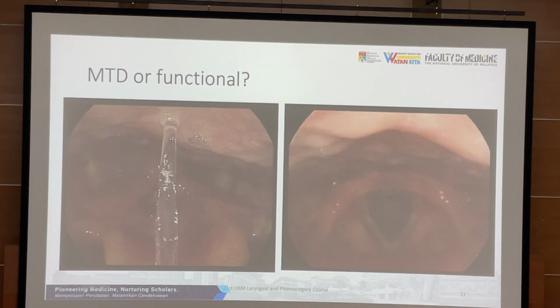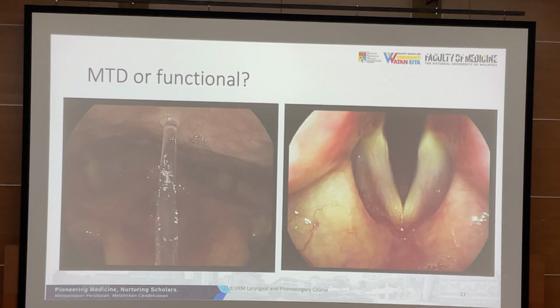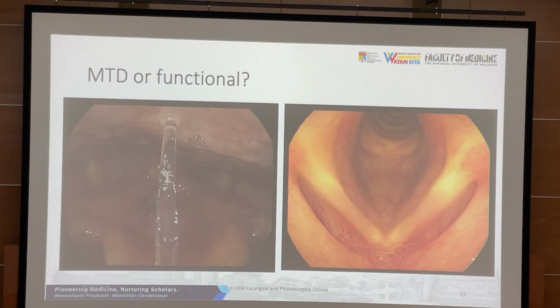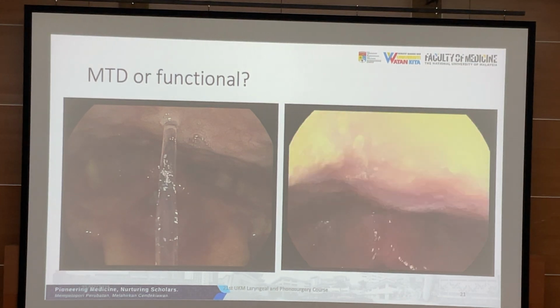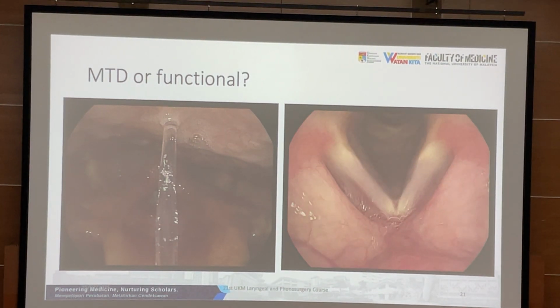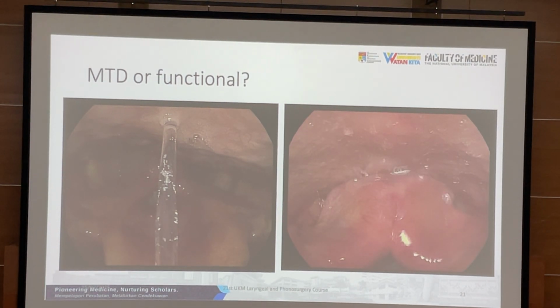There's nothing wrong with the vocal fold. Everything is perfect. The patient is talking like this. The patient is talking. So that is the patient phonetic. The voice that you heard, E is the examiner. It's like, please say E. So E is not belonging to the patient. The patient is talking like this.